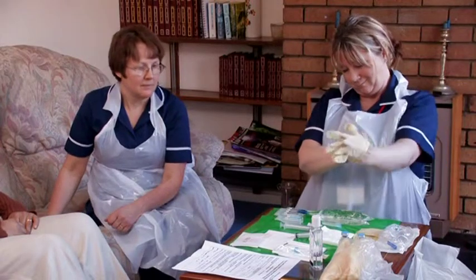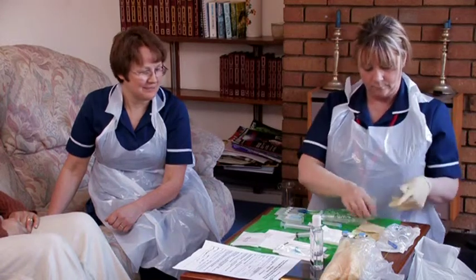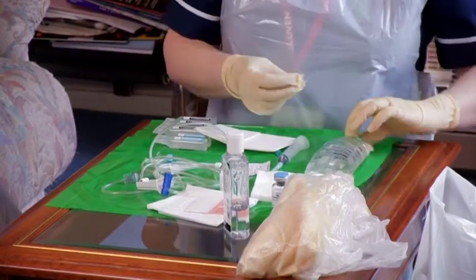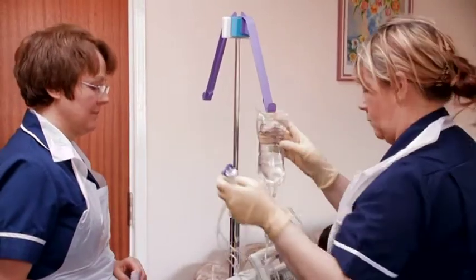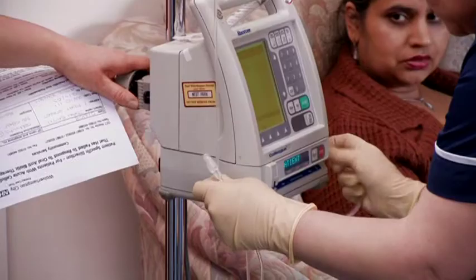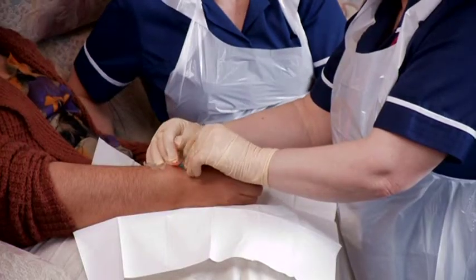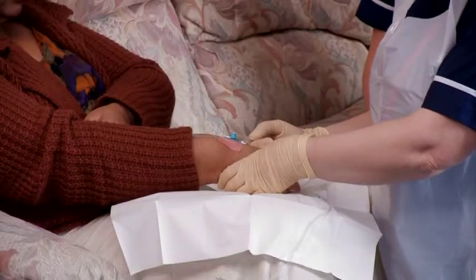When beginning the procedure to prepare drugs, first clean your hands and put on an apron and gloves to minimise the risk of infection. Make yourself a clean work surface using sterile towels to prepare the equipment. Check the bag of fluid for leakage or cloudiness. Observe for contaminated fluids. Check all drugs, fluids and patient details prior to administration to maintain the safety of the patient. Preparation and administration of the drugs should be carried out according to the clinical practice for IV therapy.